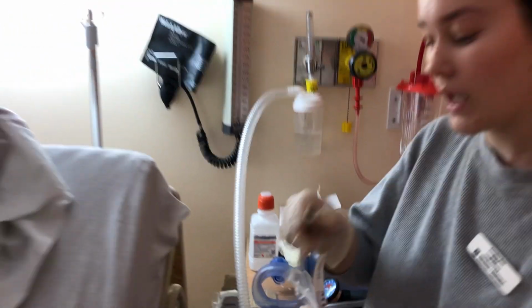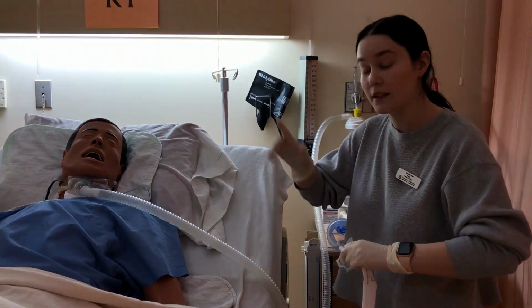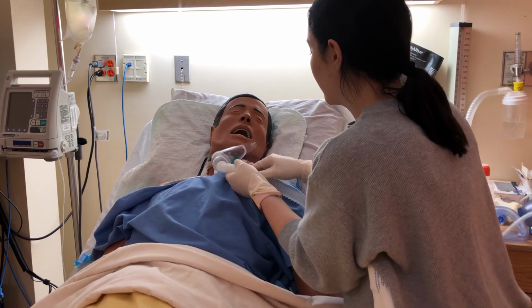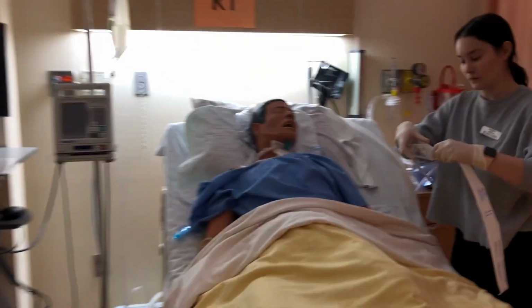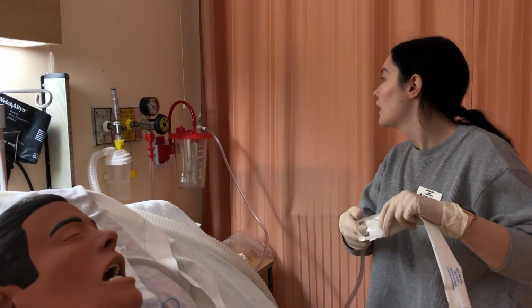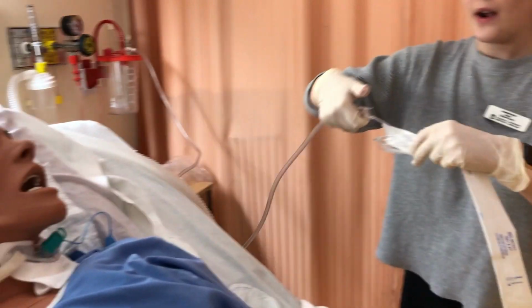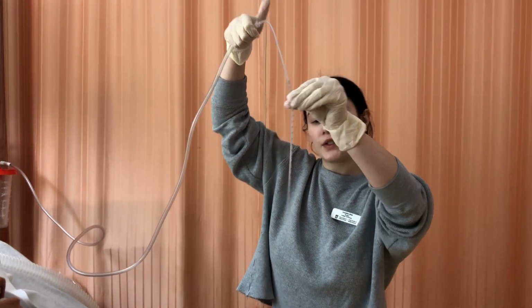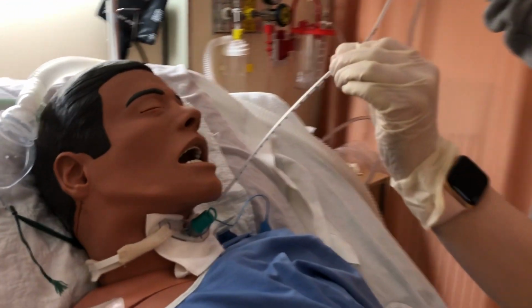Okay, I'm going to connect. My patient's oxygen saturation is at 100%. They've taken a couple of deep breaths, and I'm going to remove their oxygen source now. I'm just going to check again. Good, I'm within the 80 to 120 here. And as I'm withdrawing this, I'm keeping the first 5 inches sterile.